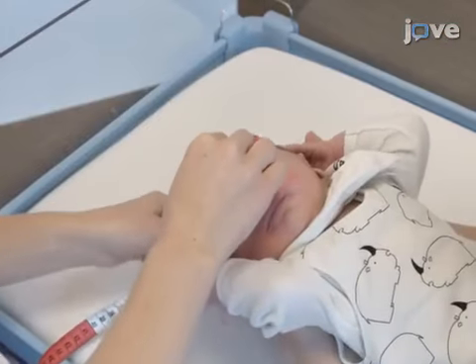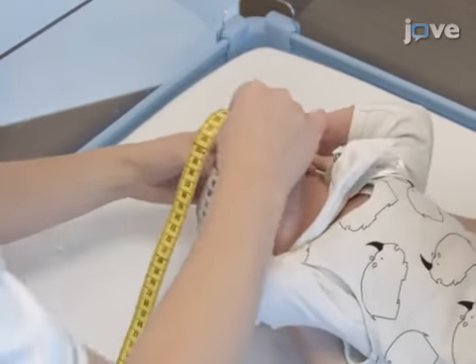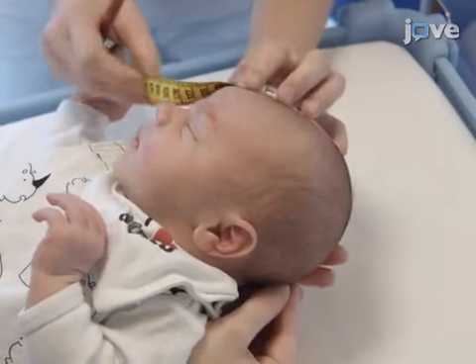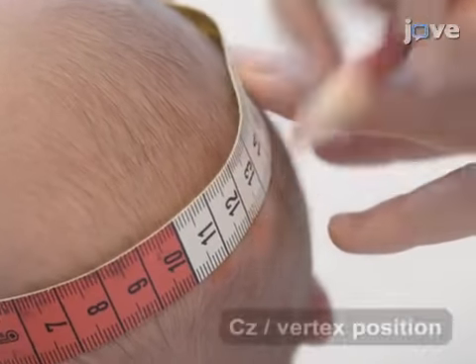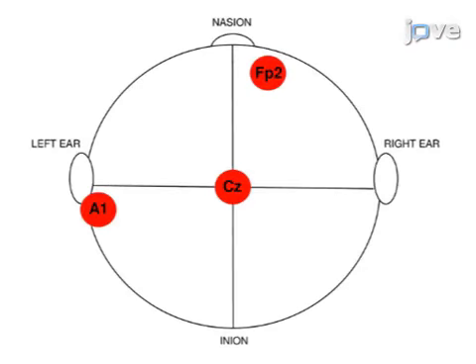Measure the neonate's head circumference with a measuring tape to define the size of the EEG cap. Then identify the active electrode position by marking the middle point between nasion and inion and the middle point between the left and right preauricle point with a skin marker pencil. A schematic of the electrode positions is shown here.